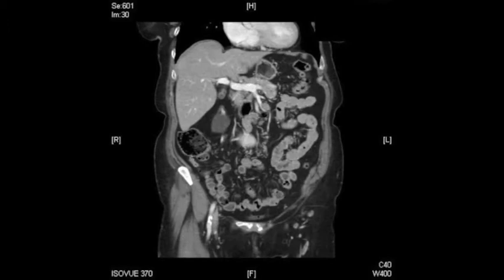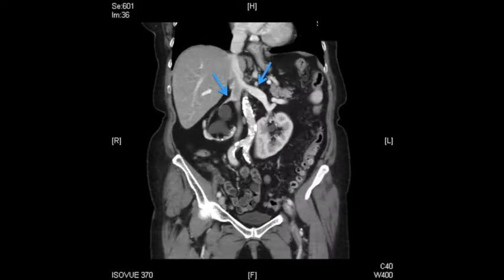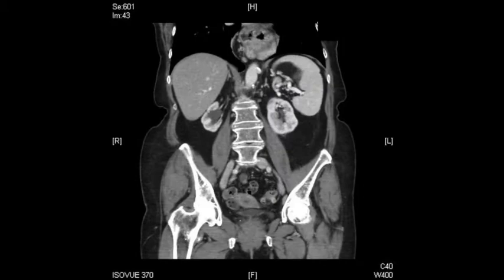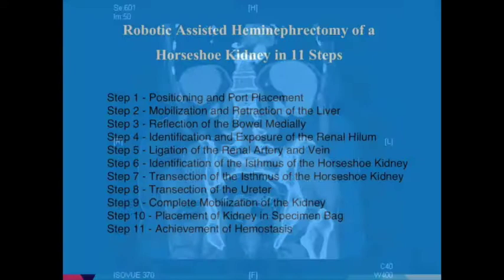A CT urogram of the abdomen and pelvis demonstrates a horseshoe kidney with the isthmus clearly identified. The scan also demonstrates the anterior and superior displacement of the renal hilum, typical of a horseshoe kidney. There is delayed uptake and minimal excretion of IV contrast from the right hemikidney. The left hemikidney appears normal.